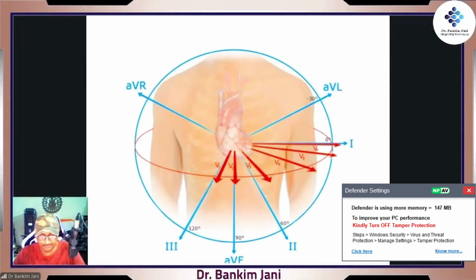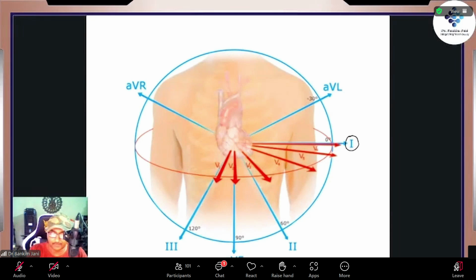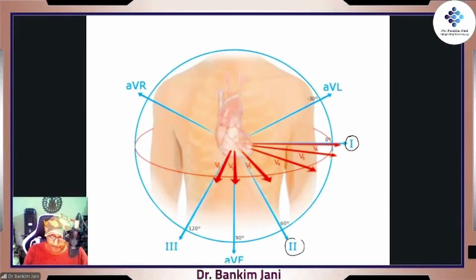Just have a look at this image. This is a display of actually all the leads. So right now we'll be dealing with these leads: 1, 2, 3.